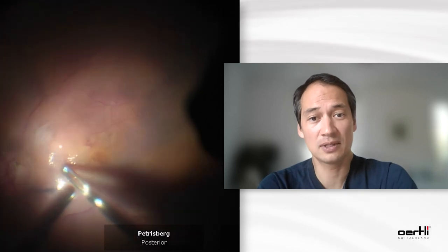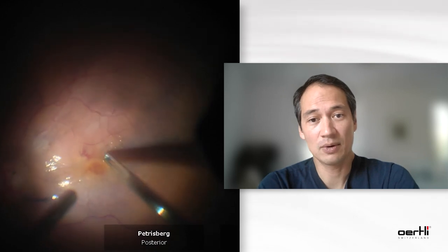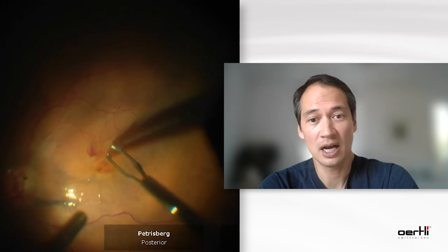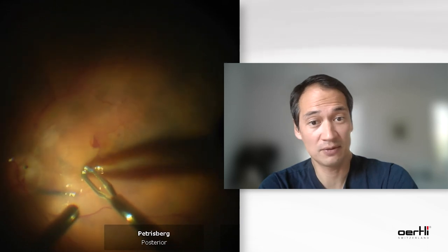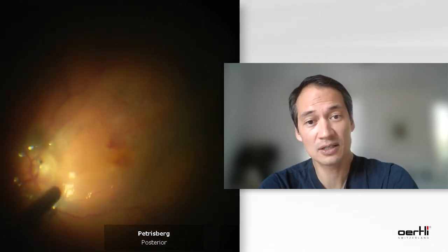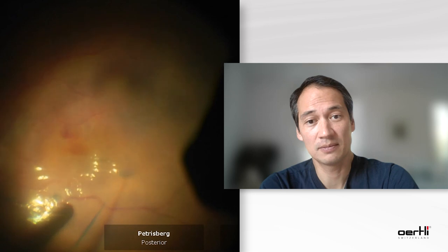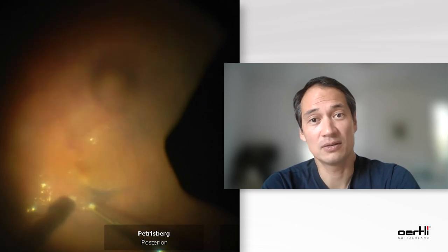And once you see this area and the edge of the membrane, you cannot unsee it. And this gives you an immediate orientation. Afterwards, the peeling in a very challenging situation becomes a lot easier. Therefore, I've made quite a habit out of this — that in challenging cases, or even in standard cases where I'm not sure about the visualization of where the edge of the peeled area is, I just quickly change the light settings with my foot switch. As you see here, I don't have to really remove the instruments from the eye or change anything. The light just changes like that, and I can do it deliberately. And this just gives me the extra security to see where we are with the peeling area. So this is my most favorite innovation in the foot switch.